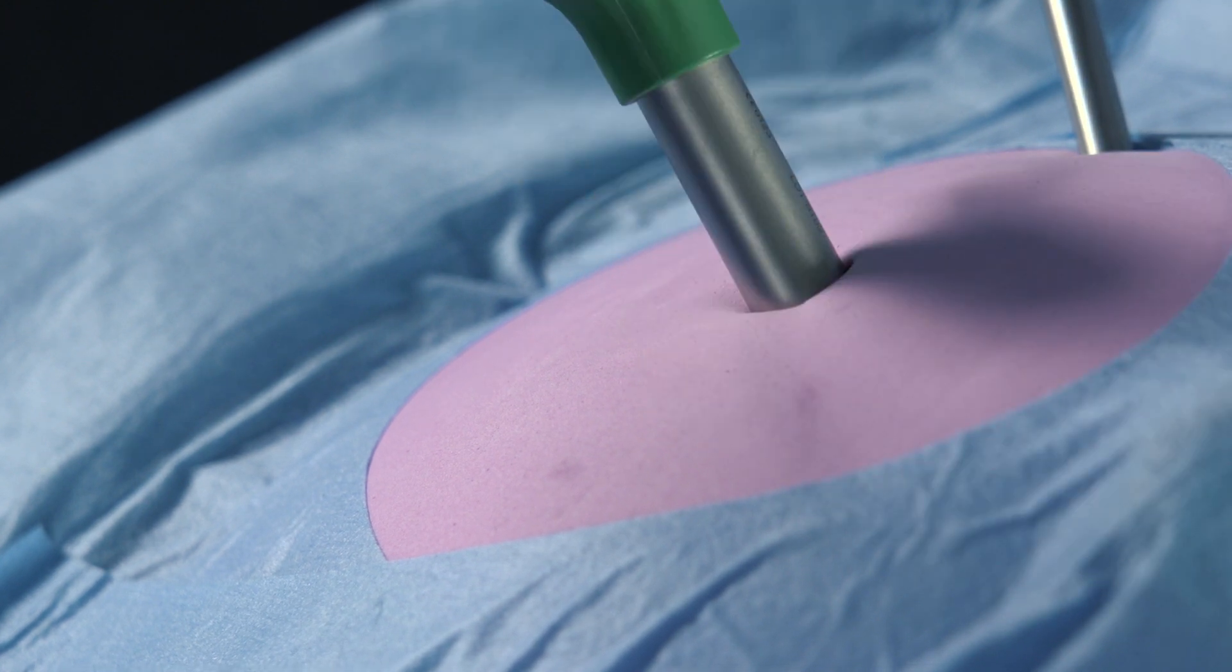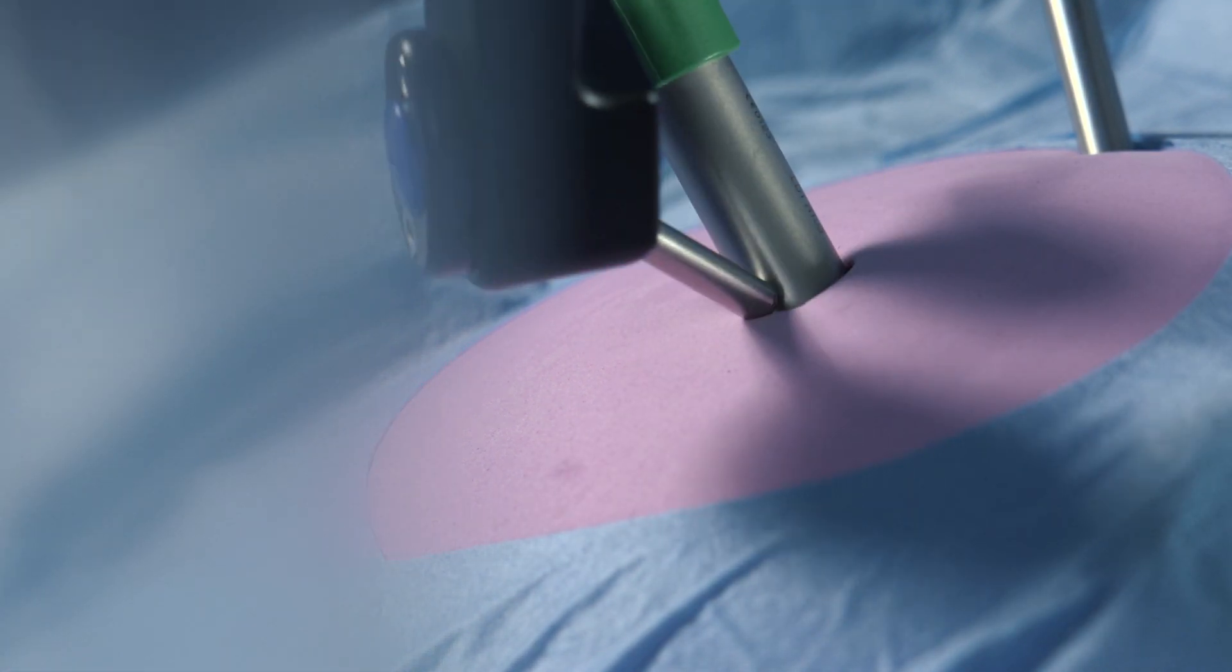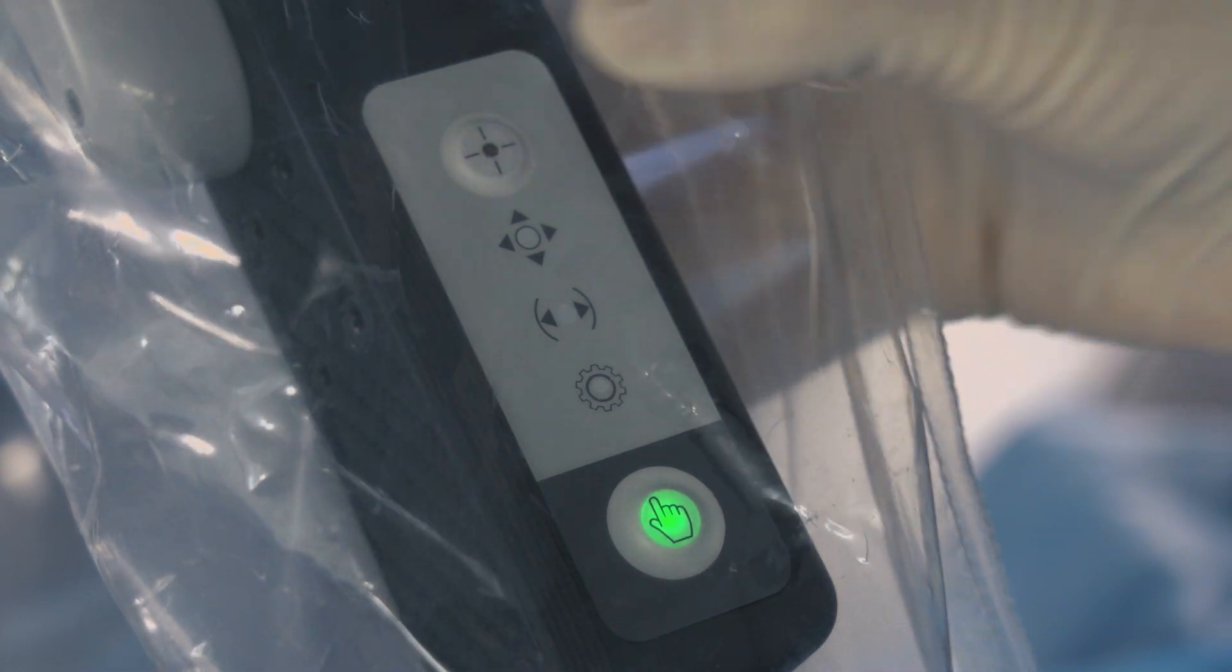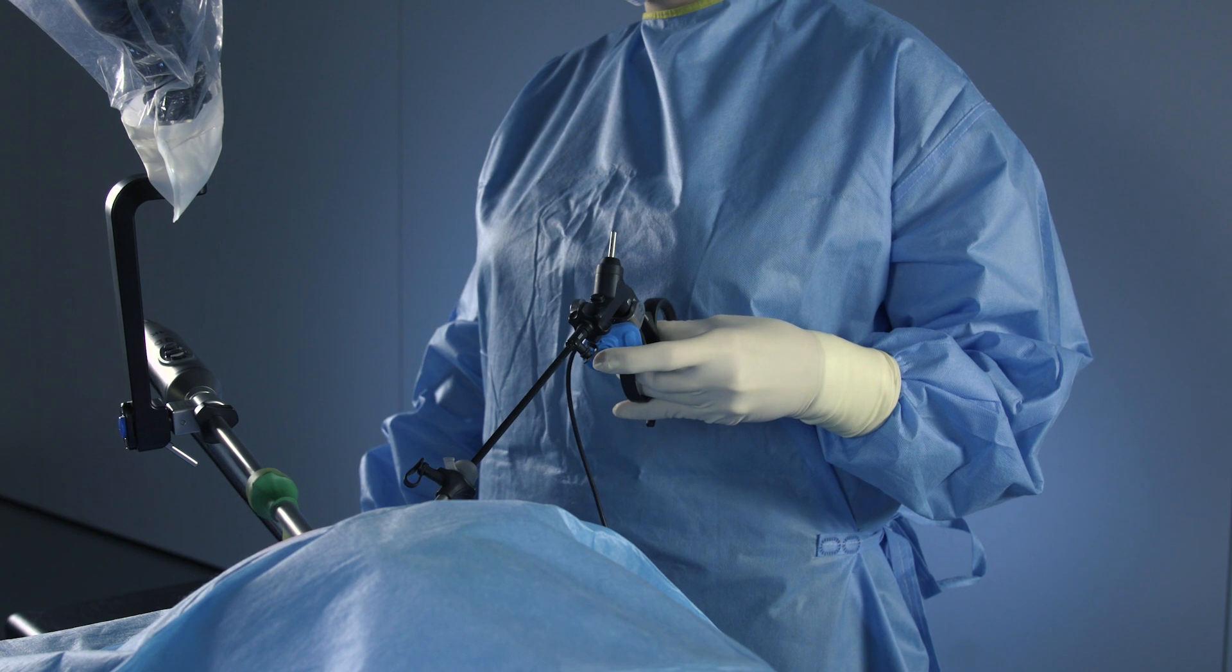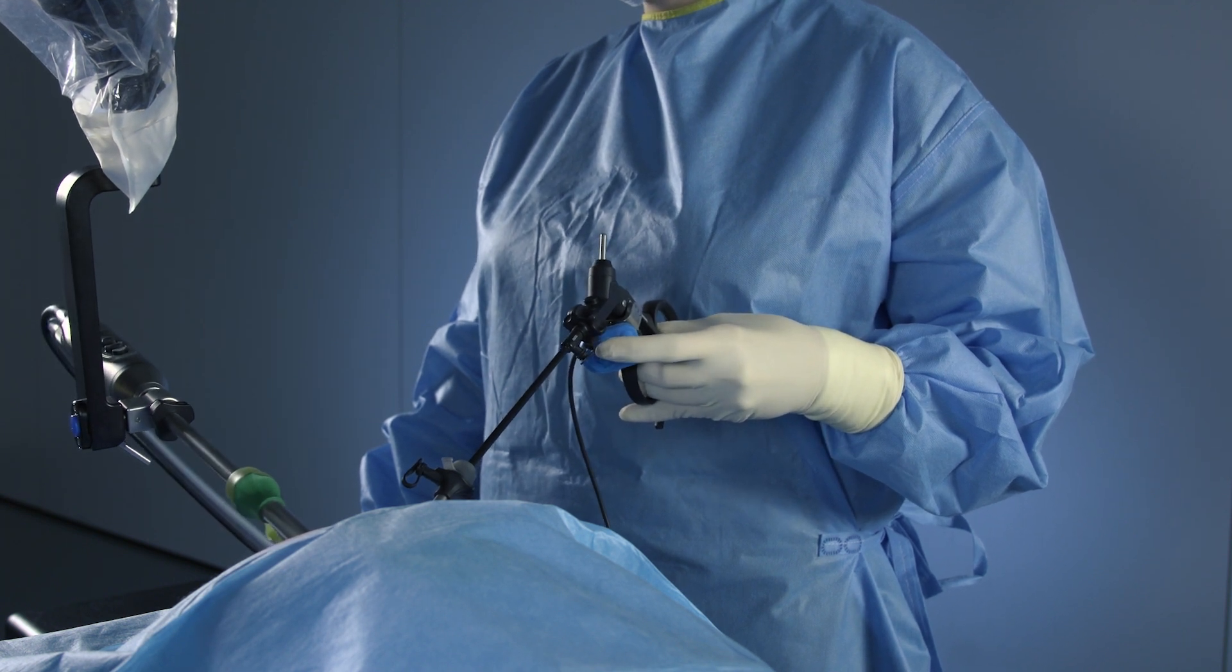If you need to move or change the trocar during your procedure, you must set the new trocar point again. During the procedure, if you need to adjust the position of the universal joint, you will not have to reset the trocar point.